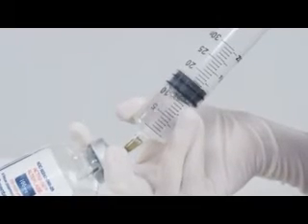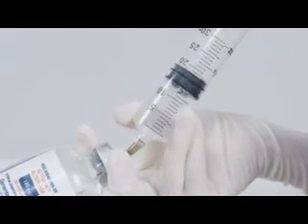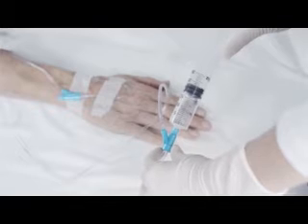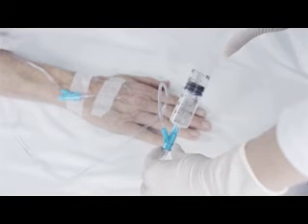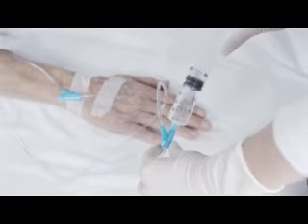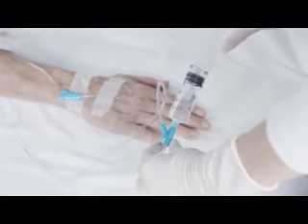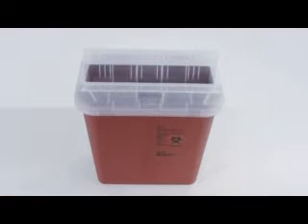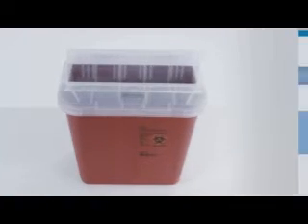Do not prime the syringe with air. There is also an alternative method where you can prepare the infusion set and remove excess from the Y-side injection port. It is important to properly discard the excess quantity.